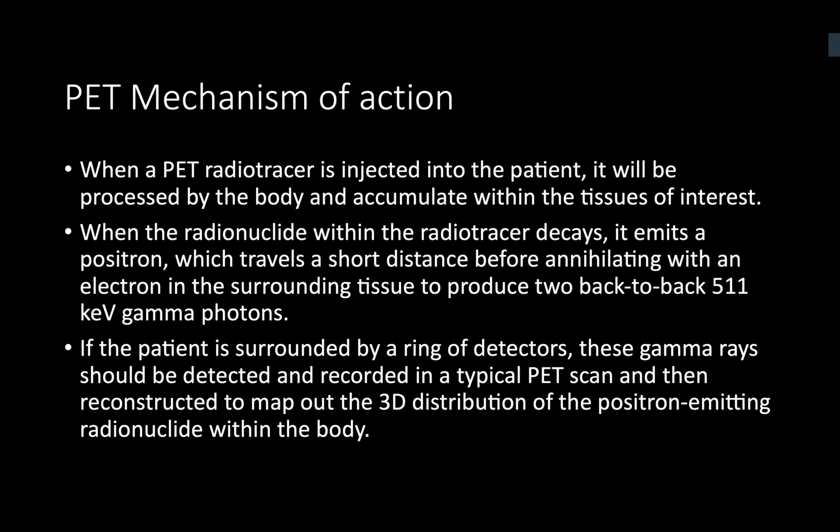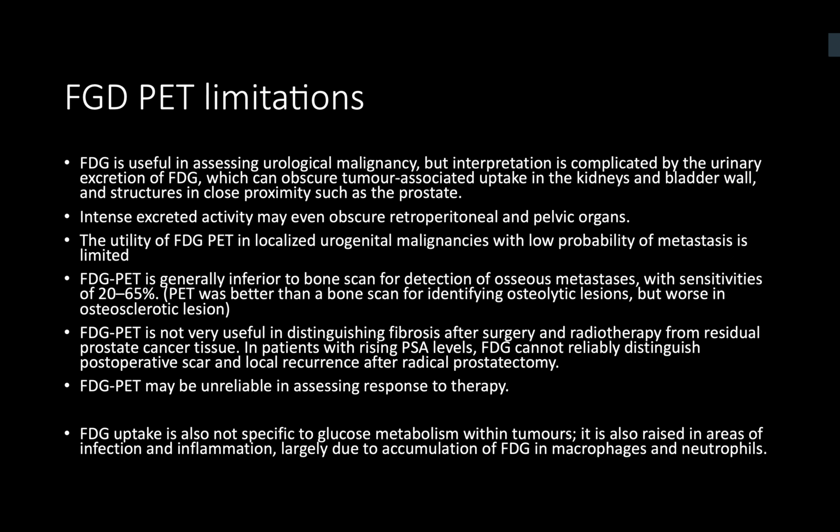That is picked up by the gamma cameras situated around the patient. So it's basically a gamma camera, put like a sensor all around the patient in a PET scanner, and then a 3D image is created with the computer.